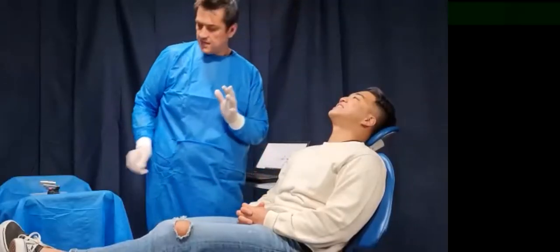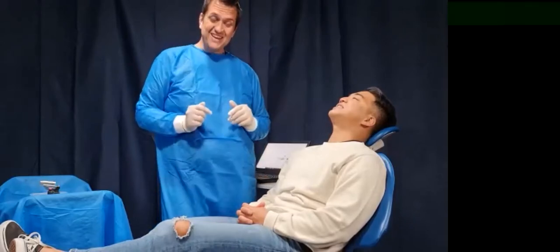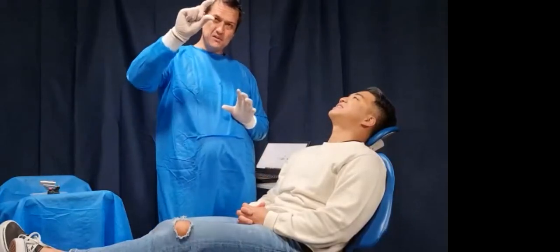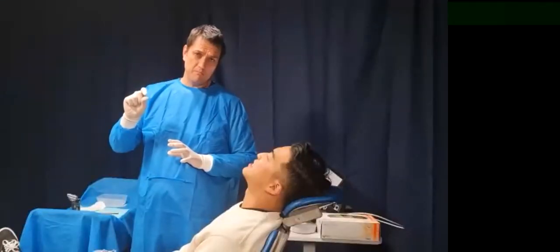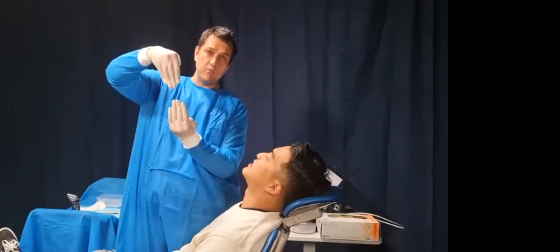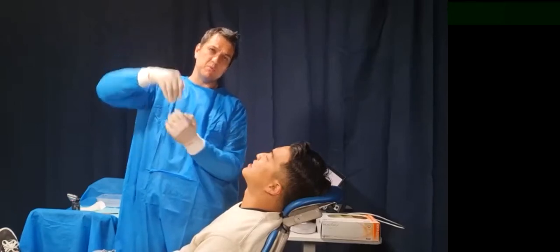And what that then does is it gives me visibility so that on my next stage, which I'm about to show you, I'm actually going to see the centrals coming together, and then I can stop them before they, again, obviously get back to centric. So my objective here now is the incisal opening that I will produce right now. I want that to be around about the same as what a splint would be.